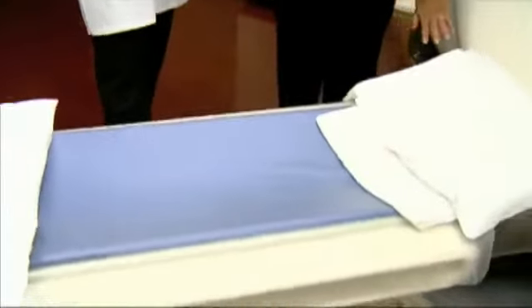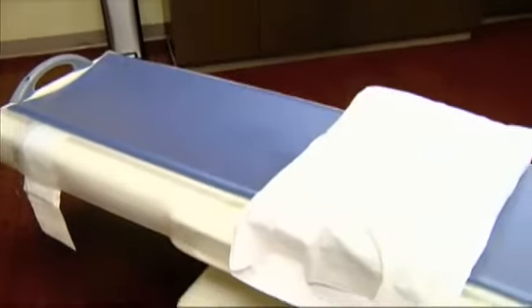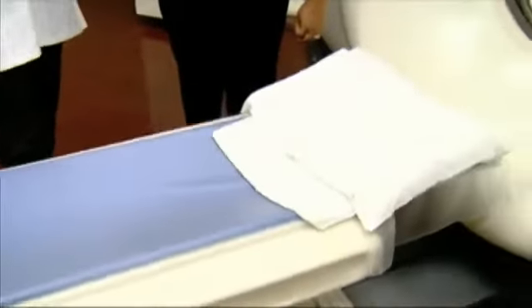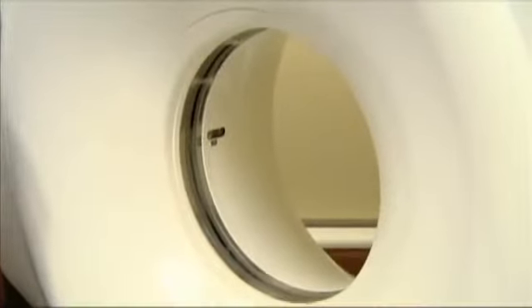All right, and of course you were explaining to me that when you come in, you lay down on the machine, and what's the next step? They will go ahead and protect you. Depending on where the CT is going to be done, they may put lead on the rest of your body to protect you from radiation. This machine does use radiation, but it's a minimal amount. It's less than being outside in the sun for 5 days. The goal is to allow you to lay on here, to relax, take slow, deep breaths, and let the machine slide you in and out of the donut. Nothing ever touches you. All right, that is good to know.